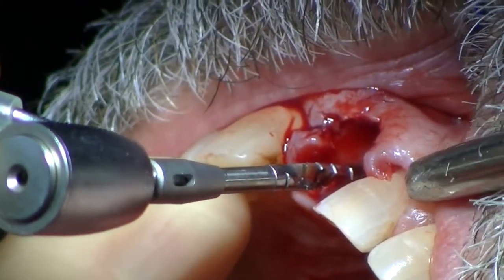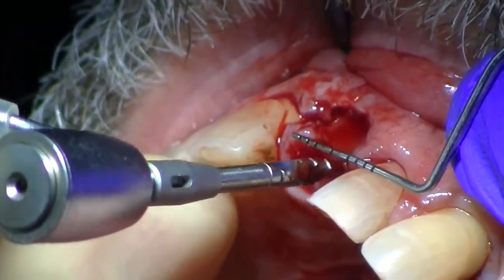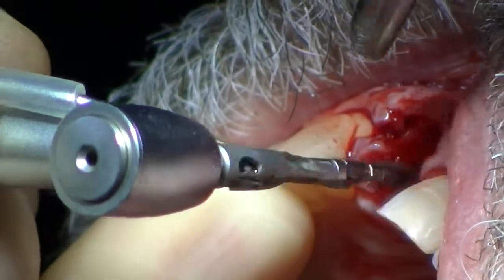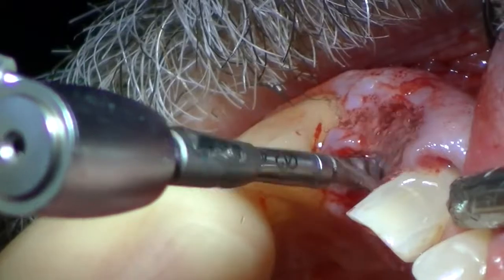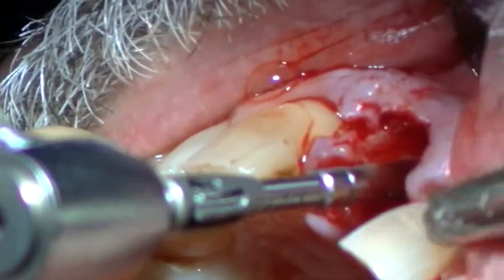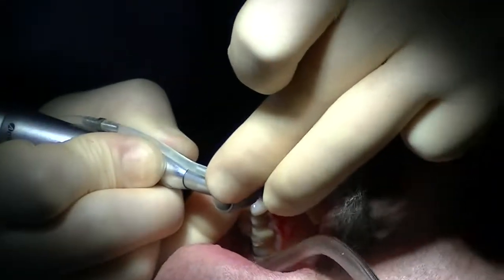Could you put a perio probe on? So, yeah, you can clearly see. I'm gauging the palatal wall. That's fine, thank you. And then we'll suction. I'm going to go to my 3.0 diameter burr. I can clearly see that line. I'm trying to use 2 hands here. Suction, please. Suction, please.